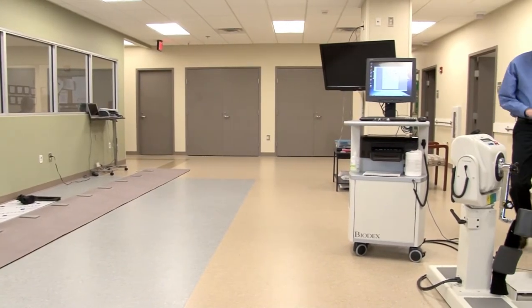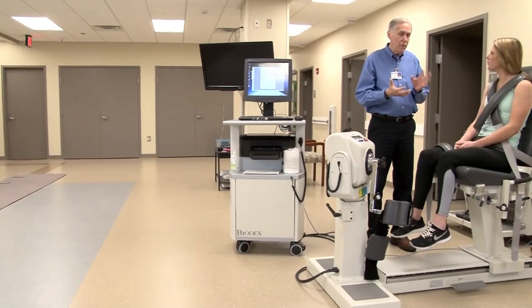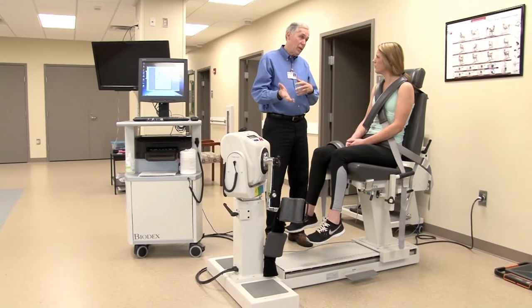I administer, as part of the employee health program, the physical agility test which utilizes an isokinetic machine that measures strength, so that we can ensure that any person coming into Tidelands Health would be able to demonstrate that they should safely be able to perform at their specific job level.